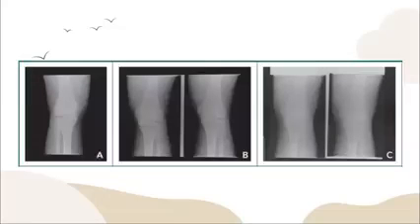Okay? Ayan. Kani siya ang mahitabo pag nag-fail ang inyong segmentation. So, this is the one view per plate. Two views, natarong ang segmentation per plate. Kani siya wala siya natarong because as you can see the image is underexposed. So wala natarong og identify ni computer na ay duha din ni ka images. Okay, so ang pagbasa niya is one image because as you can see, dili equidistant ang ilahang gaps.